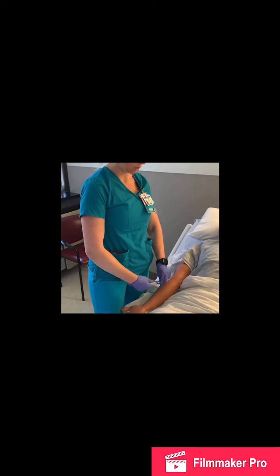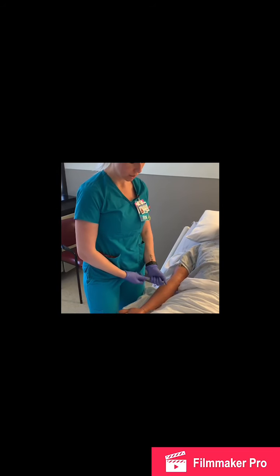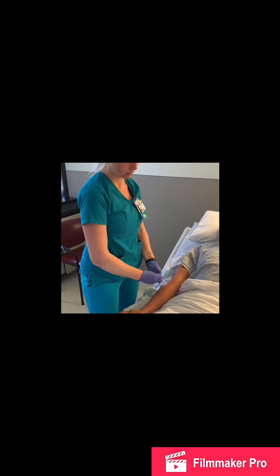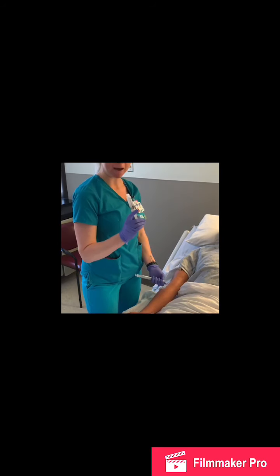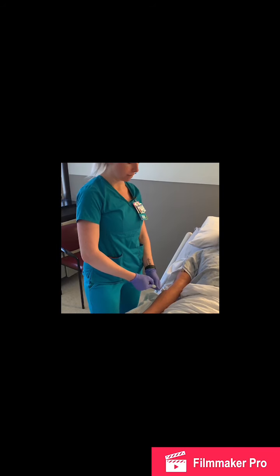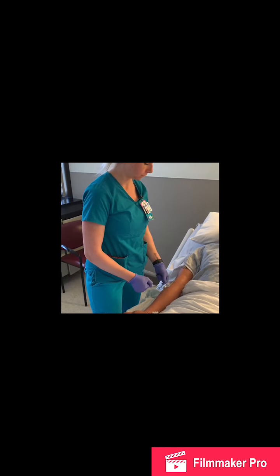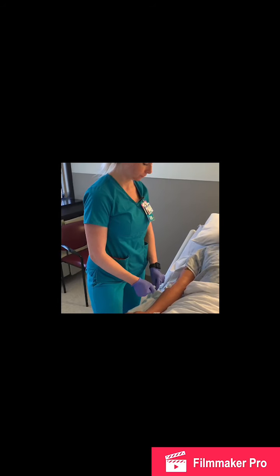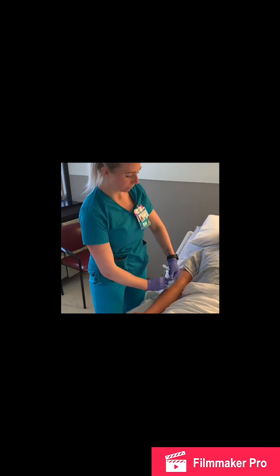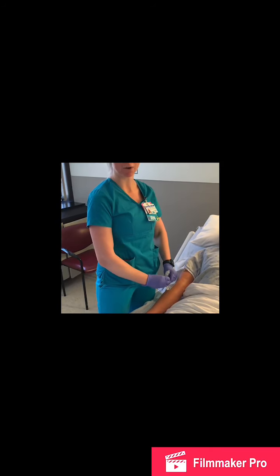All right, so I just finished pushing my antibiotic in, so I'm going to disconnect my syringe, and I'm going to scrub off my hub. I'm then going to take my normal saline flush, 10 mils, just like it said in Epic, connect it to the hub, and I'm going to give the IV a good flush. After that, I'll disconnect. I'm going to lock my line off, and then I'll make sure that I clean one more time with a fresh alcohol pad.